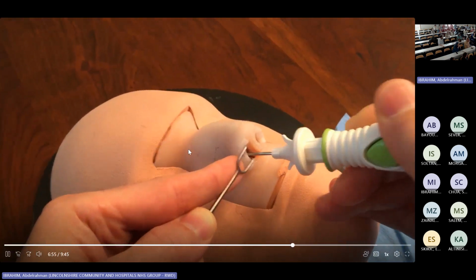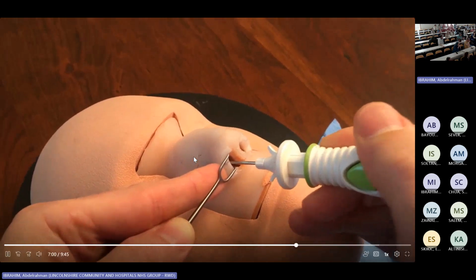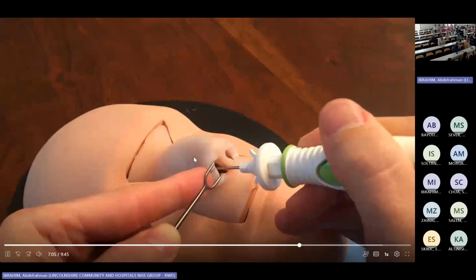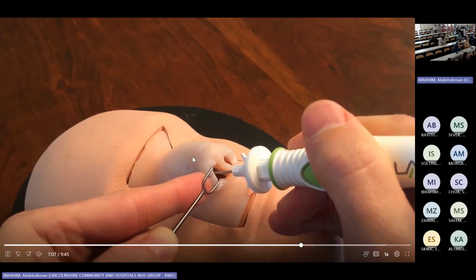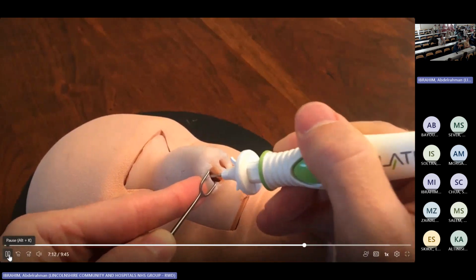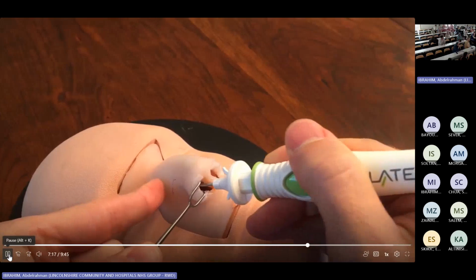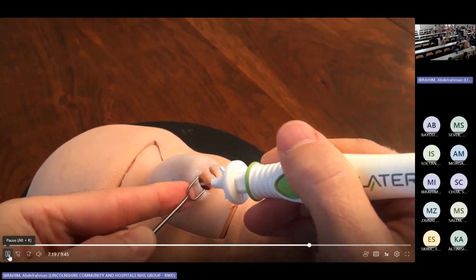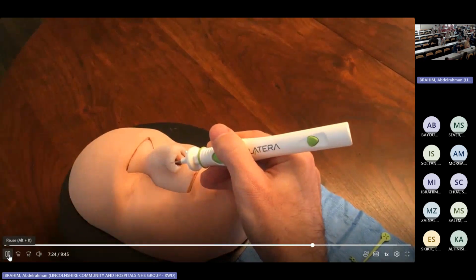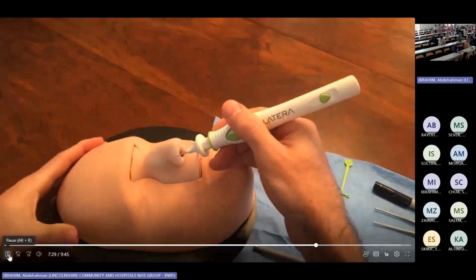I feel the nasal bone right here, so that means I know exactly where the tip of my cannula is. So that's a good anatomical orientation or marker. So I can push the bevel and glide it right up over the nasal bone. Continue pushing to my distal mark. So lateralize, I can palpate, feel them right on that distal mark. So that is the completion of the plane. I will drop my double prong skin hooks. At this point, we're ready for the third P.